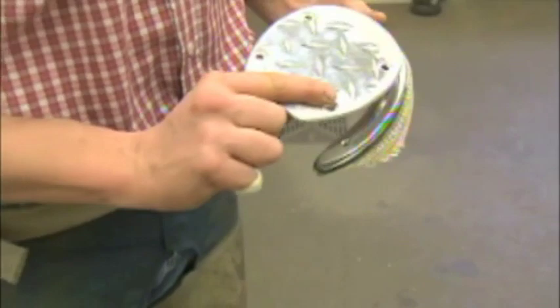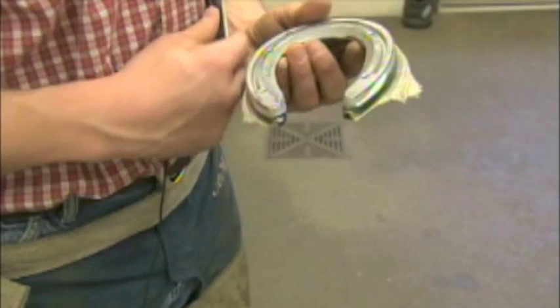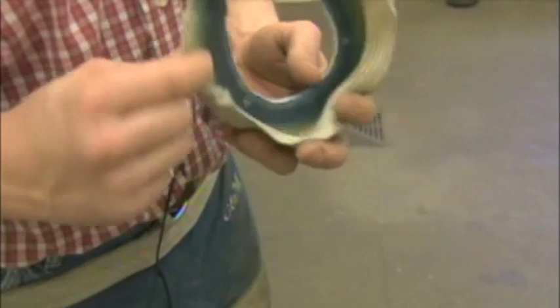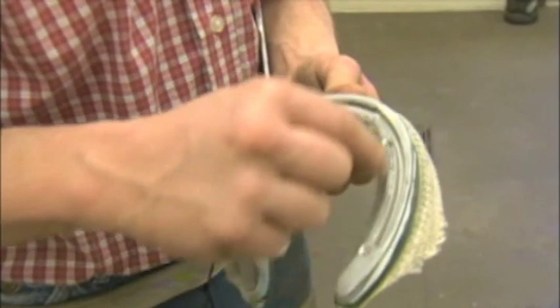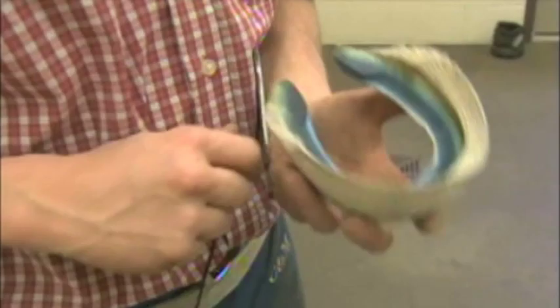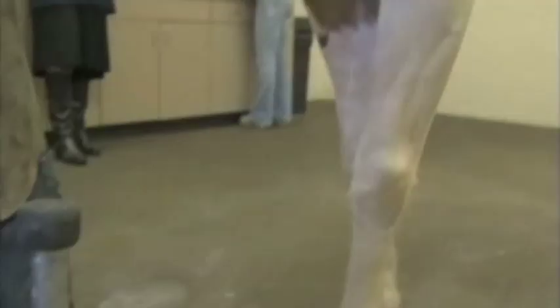Here's the shoe we're going to Equilox on, and here's the treatment plate - this gets bolted on there. I'm going to remove the treatment plate for the gluing process and put some tape over these screw holes, because the last thing you want is to get Equilox in those holes while you're gluing the shoe on. That really clogs up the holes and it's hard to get it out once it sets up. So we'll put a little bit of duct tape over these holes on the ground surface as well.